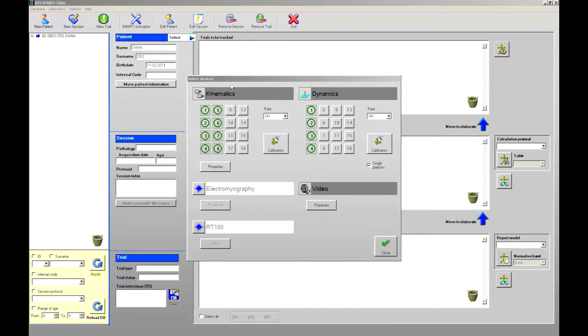From this window we can enable or disable the different devices, depending on which of them will really be used during the data capture. By default, kinematics and force plates or dynamics are always enabled. To enable or disable a device, I can click with the left mouse button on the corresponding box. A component will be active or enabled when the corresponding box background is colored in gray, and disabled or not active when the corresponding box is white.